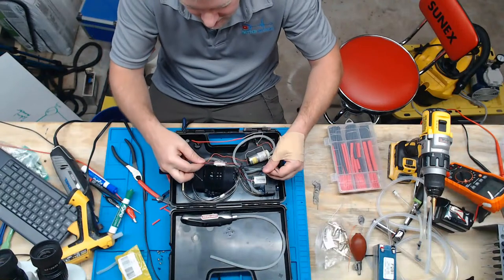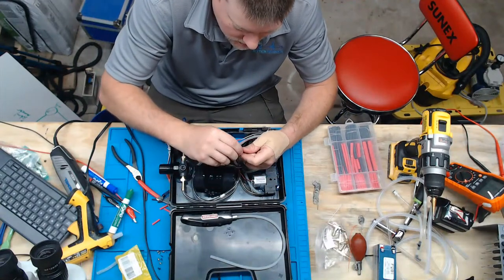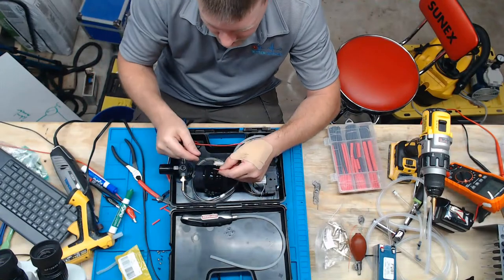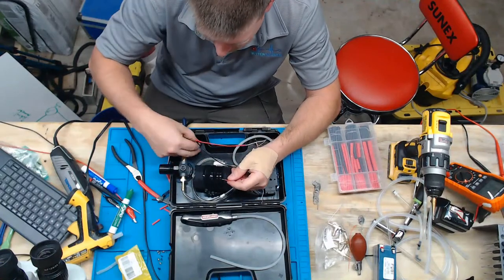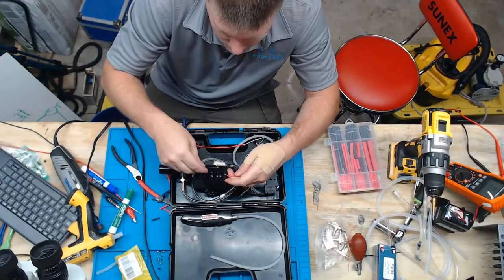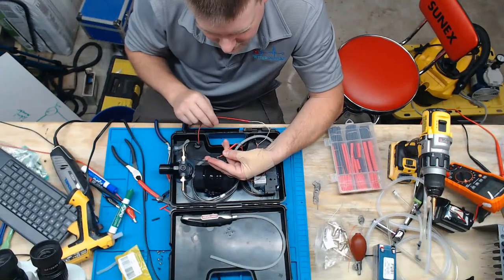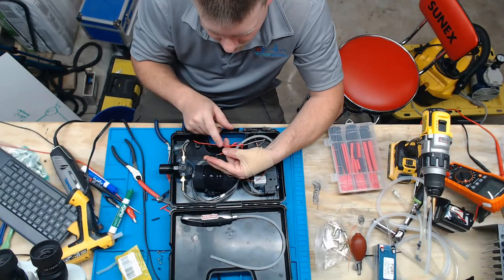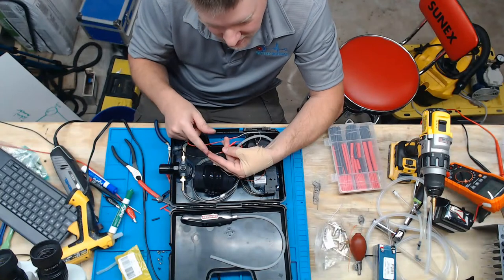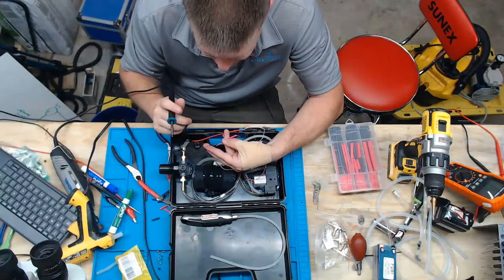Okay, so since my positive leads, here, that's going to drive me crazy. Oh, shoot. Anyway, I should have untangled them. All right, so my positive is coming through over here. Let's put it on the side. It's going to match up to this guy. You see my technique for putting these wires together. I hold two of them with my forefinger and my thumb, and then I hold my other wires with these two fingers over here. It's just the way I've been able to do it for years, and it seems to work out pretty fast.